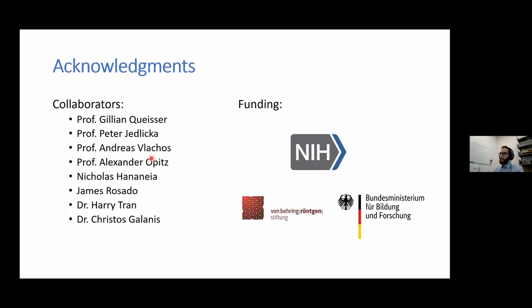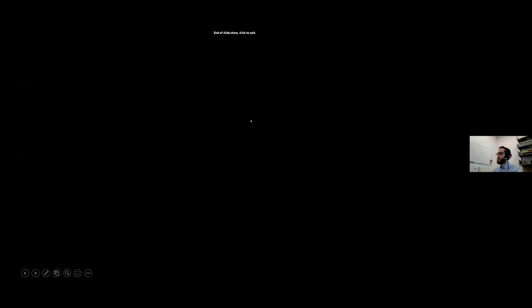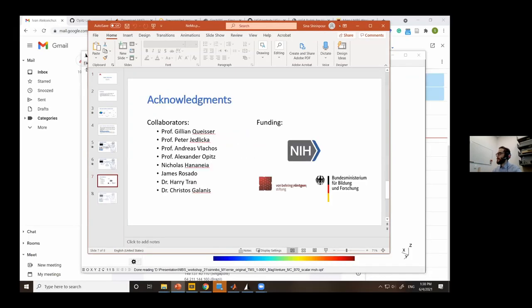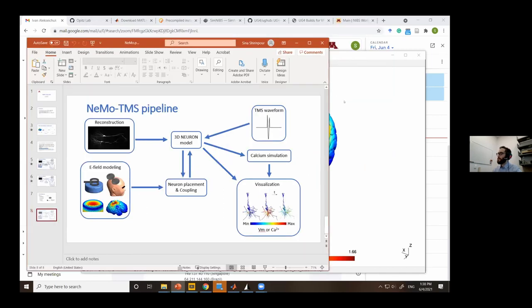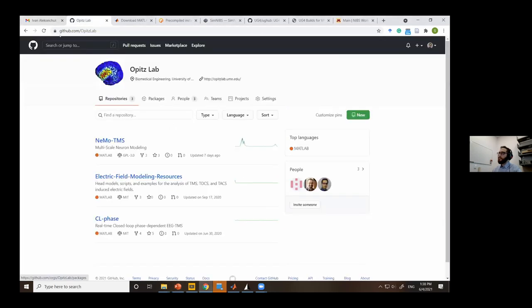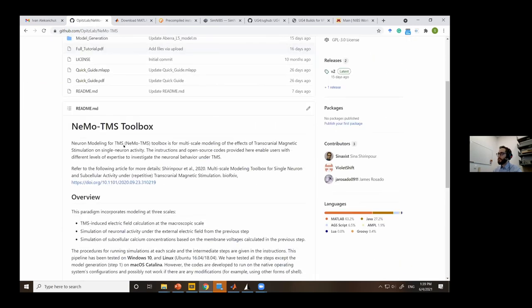Let's go directly over how to run NEMO TMS. If you go to github.com/OpitzLab, that's our GitHub. We have shared a number of resources there. If you go to NEMO TMS, this is the freely available toolbox I just described.